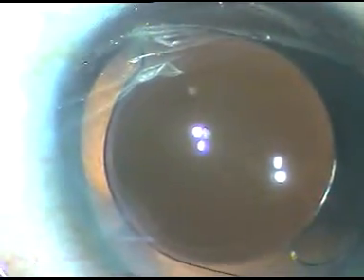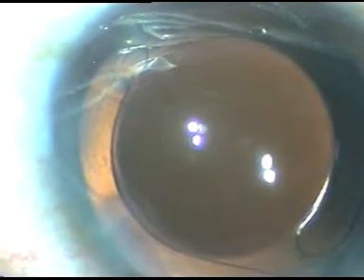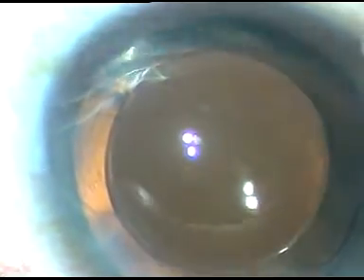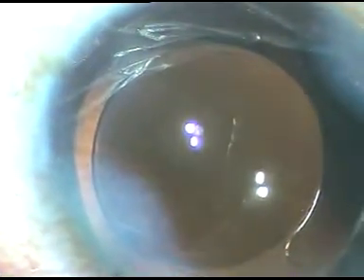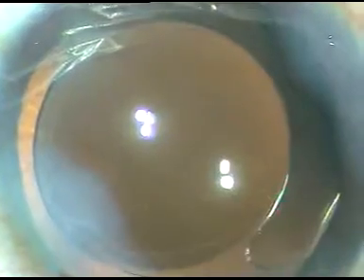Now I inject a bit of pilocarpine and moxifloxacin in the anterior chamber. This is pilocarpine and this is moxifloxacin. And now I hydrate the side ports to make the side ports watertight. And now at this time a final wash is given. This is the final lavage of the anterior chamber.